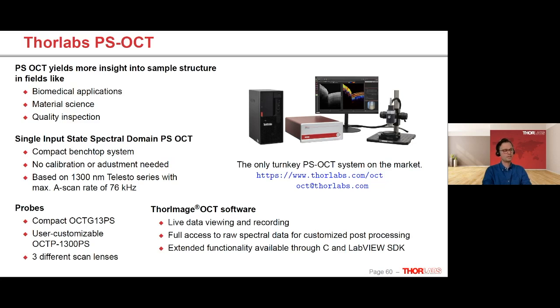Maybe I can start. I think we can use the fact that for most imaging conditions, we have enough reference light. So we have more than enough reference light in our system that we can also change on the scanner the amount of reference light that we mix into the sample light to go back into our detector, so that we're only using a part of the reference light.